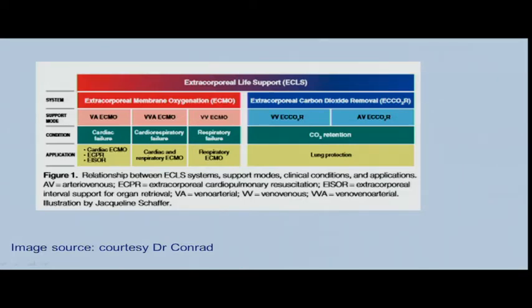Another thing that I discovered was that we also have the use of extracorporeal devices in cardiopulmonary resuscitation. And also in organ donors, you can use this device to help in perfusion of the organs before you are able to remove the organ.